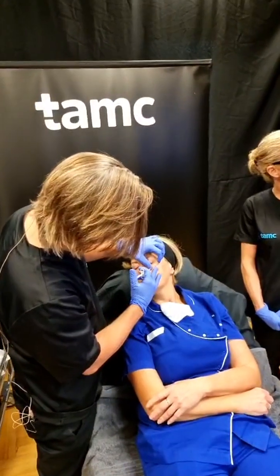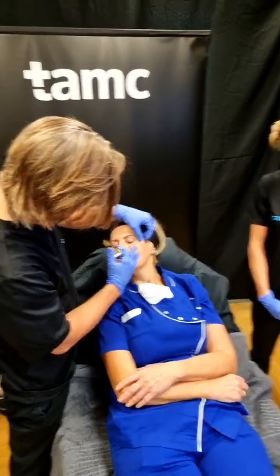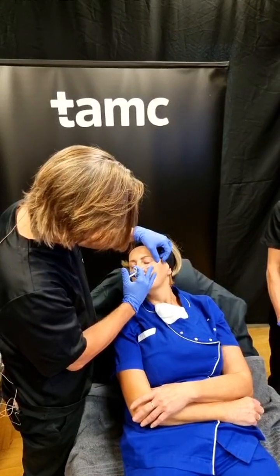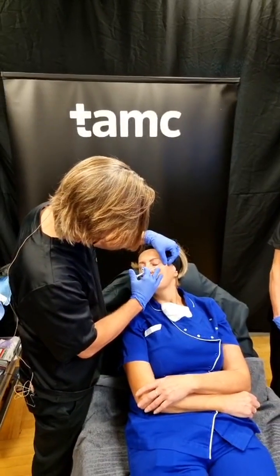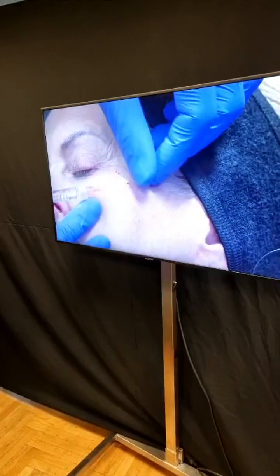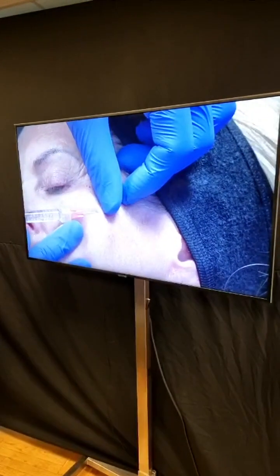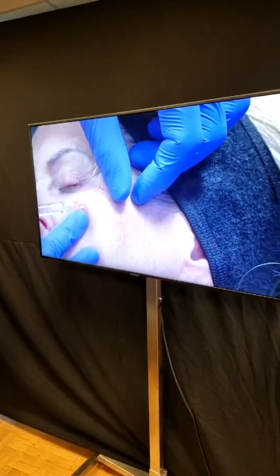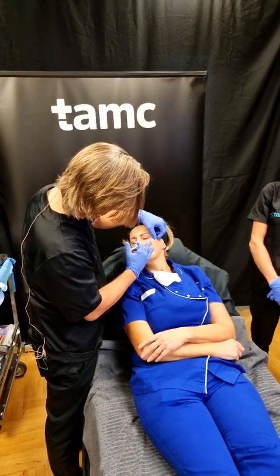Given that I had this surgery 3 years ago, we're not bothered with a surplus of skin anymore, so we can enjoy the two virtues of this hyaluronic acid: intradermal for strength, and subdermal for volume. Tom, can you tell us please about the product that you chose to do this technique?